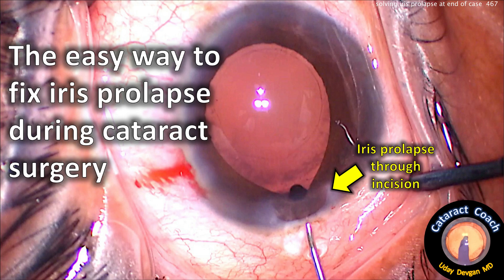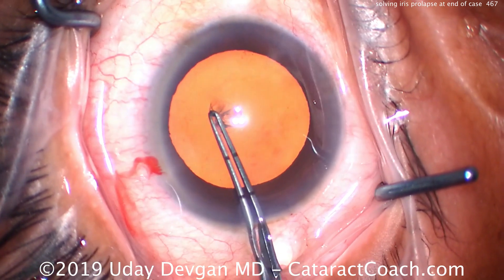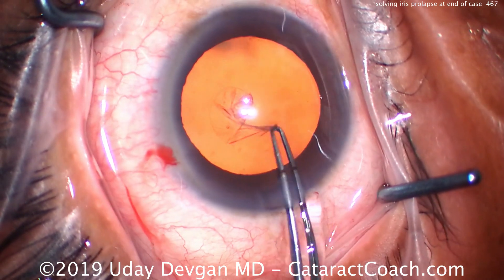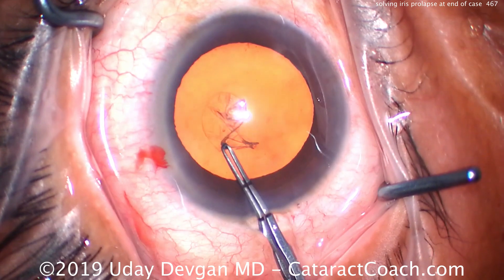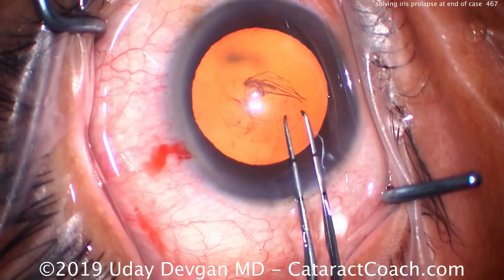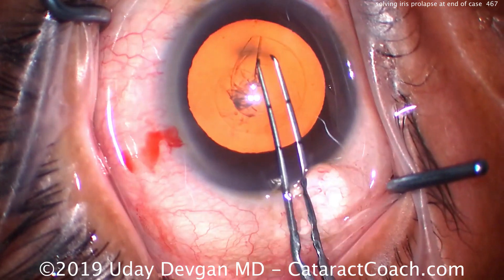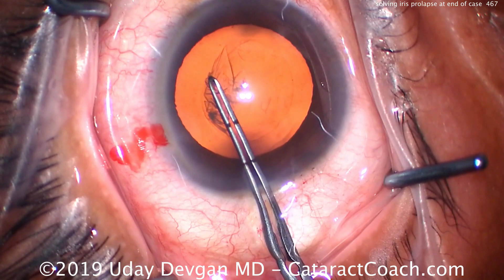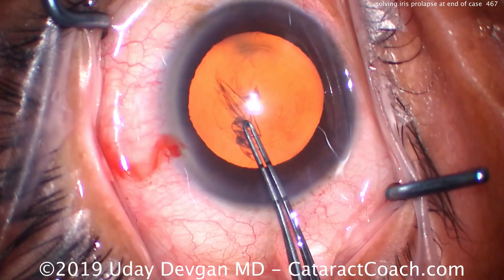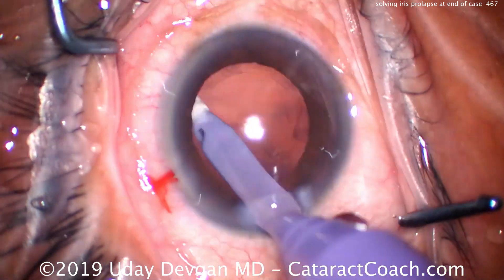CataractCoach.com — the easy way to fix iris prolapse during cataract surgery. In this case, a routine case, the initial incisions have been made and we're going to do the round capsulorhexis. Everything looks pretty routine. It's a female patient, so there's basically no chance she's taking Flomax or Tamsulosin, because of course she doesn't have a prostate.